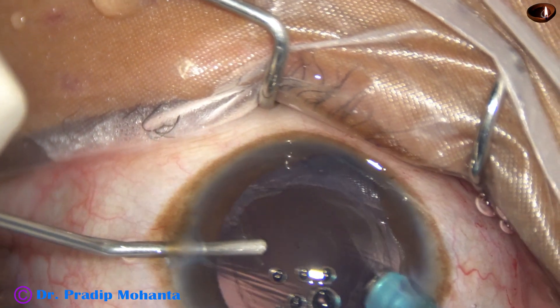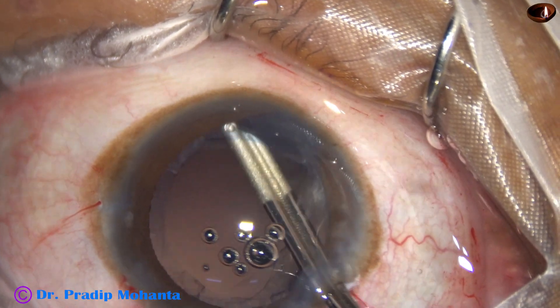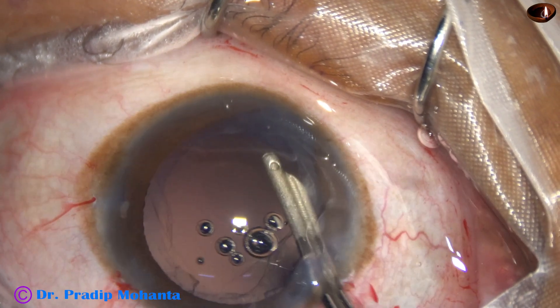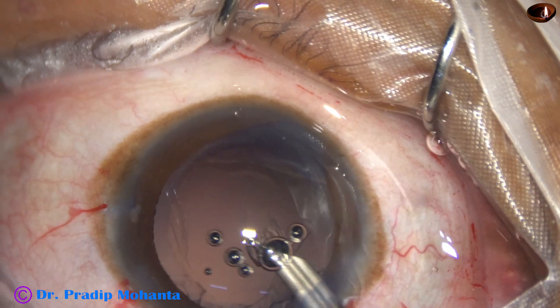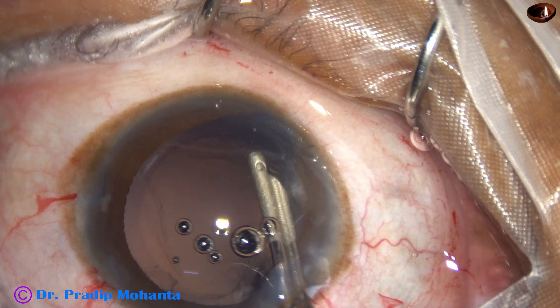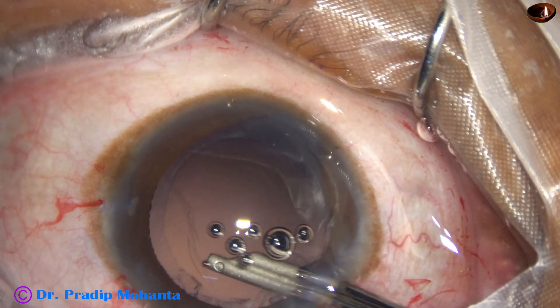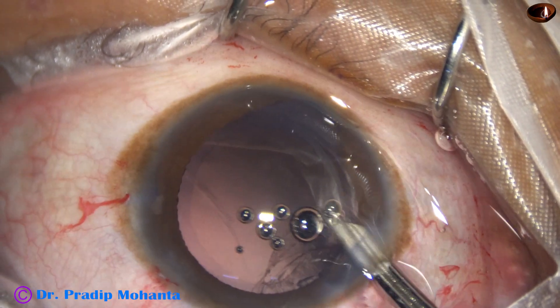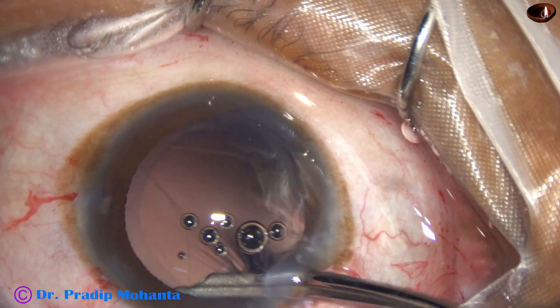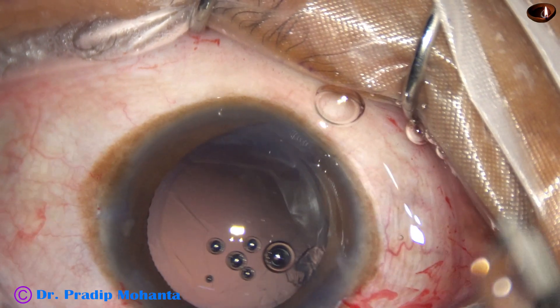Now before coming out I am going to inject visco. As I start injecting visco, the irrigation is put off — let me repeat: as you start injecting visco, put off the irrigation. Now dry aspiration of the cortex with the help of a 23-gauge Simcoe cannula. Dry aspiration means there is no irrigation, only aspiration. There is some fluid in the syringe, and every time we come out we flush it out so that we can aspirate fresh cortical matter.